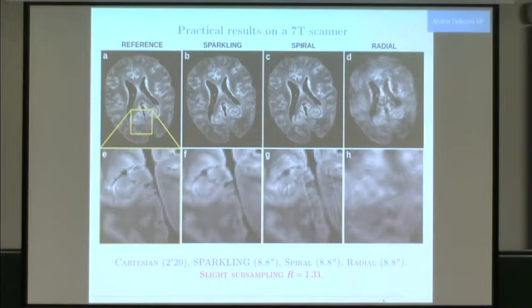And you see that basically the spiral is doing pretty well. Here we really optimize the spiral. The spiral has been in the air for like 30 years, while this is completely new, so it's hard to compete. The reason why the spiral is working so well is that you can approximate any radial density with a spiral. So it's not clear that our scheme can compete with it, but still it does. In fact, we have really less artifacts, and the reason, which is quite technical, is related to the jittering error that I mentioned, the fact that you don't know exactly the localization of your samples. If you use our sampling trajectories, these errors will be basically random. If you use a spiral, they will be very correlated, and this is why you get plenty of artifacts.